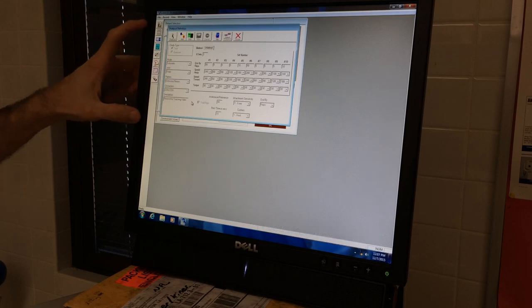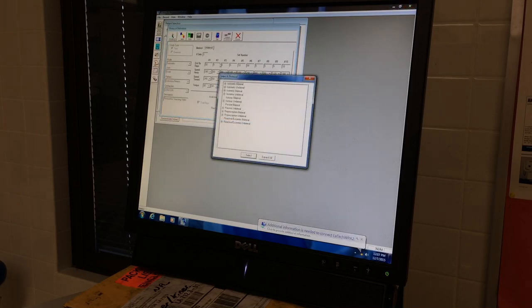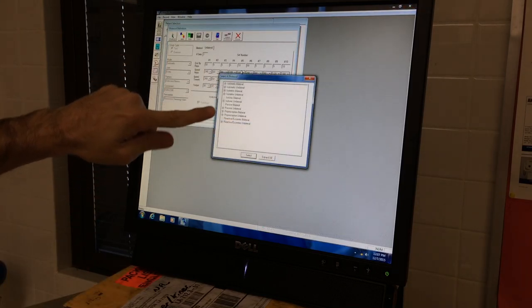The protocol you're going to use is going to be very dependent on the situation and the test, so you should be asking either the professor or your advisor which protocol you're going to be using. For this certain study, I have one set up, so we're going to click protocol. You'll see a number of different options come up.